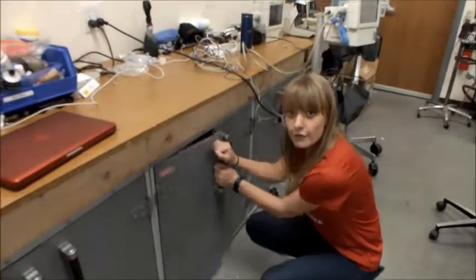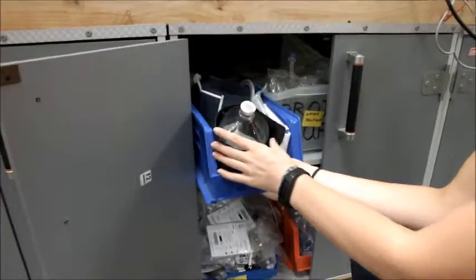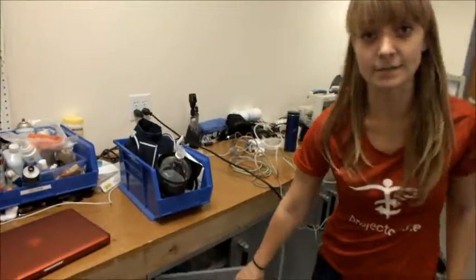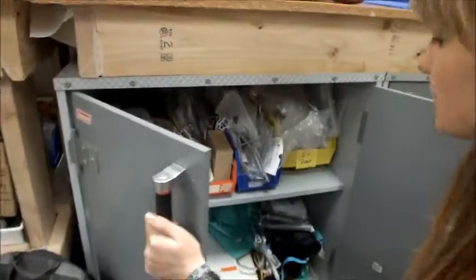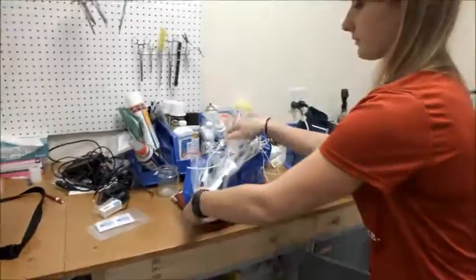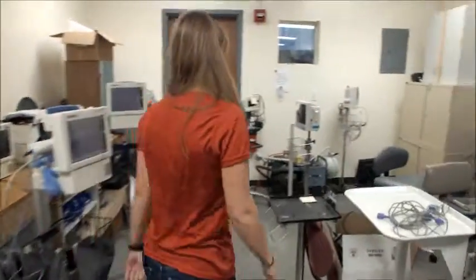Once you have your cords fitted properly, you're going to need some other tools to test your devices. In these cabinets there should be a bin with a bottle and a series of blood pressure cuffs, which you'll need to test blood pressure. If you have a temperature testing machine like we do here, you're going to need some temperature probes, which should be in a small blue container. Finally, you're going to need the SimCube, which is over in this cabinet here.